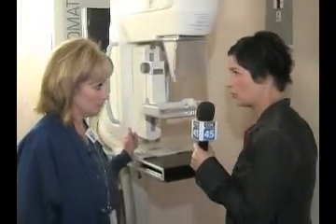Okay. And so once you have someone that comes in after 40 and they're coming in every year, you just look at those films next to each other each time? Absolutely. I compare back to make sure I'm getting all the breast tissue as we did when they were first here. And then again, those are hung for the radiologist who compares the films and makes sure there is no change. If there are changes, then we bring them back and work up those changes and make sure it's not anything that needs further attention.